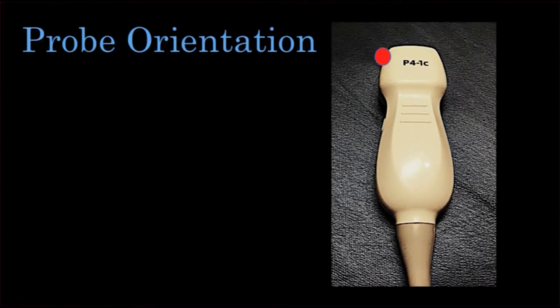Probe orientation is important because every probe has directionality to it. This directionality helps orient the user as well as the viewer of images, and there's a standard in which this is performed. For cardiac ultrasound and for anything point of care, we often talk about directing the probe orientation marker towards the patient's right, which we'll get into in subsequent slides.